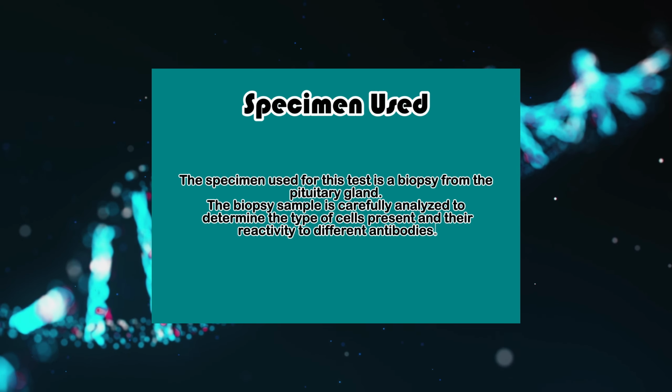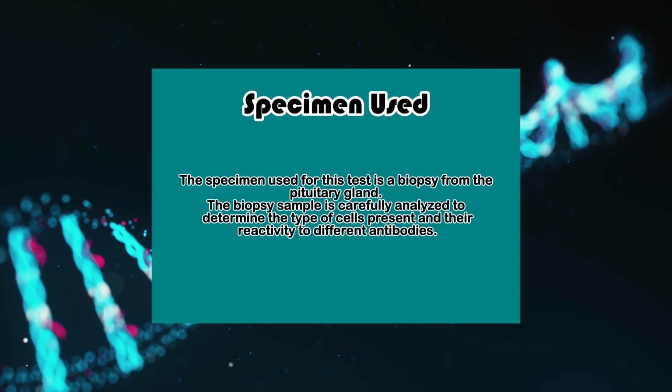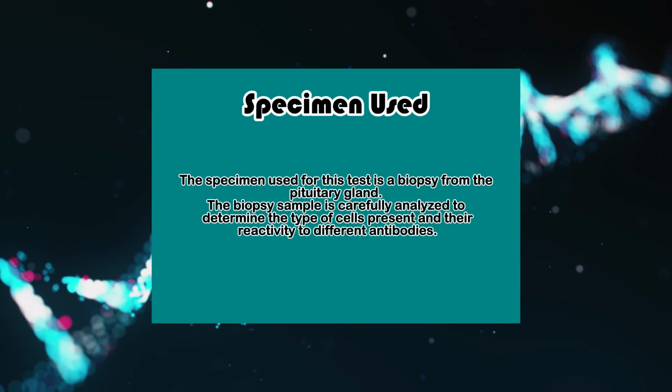Specimen used. The specimen used for this test is a biopsy from the pituitary gland. The biopsy sample is carefully analyzed to determine the type of cells present and their reactivity to different antibodies. Components included in the test.